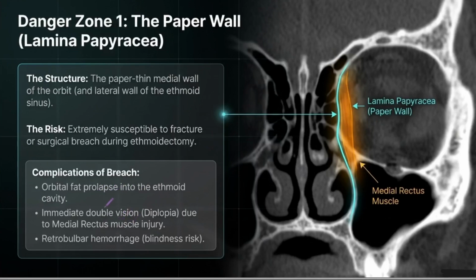Almost instantly. Identifying the presence of an Onodi cell on a CT scan beforehand transforms that image from a simple diagnostic map into a literal survival guide. It dictates exactly why doctors analyze the precise shade of gray, or why they obsess over whether a specific microscopic air cell is located anterior or posterior to the basal lamella. The anatomy is a minefield, and the scan is the map.